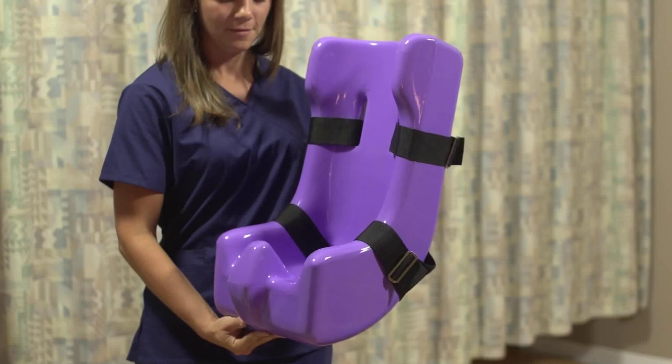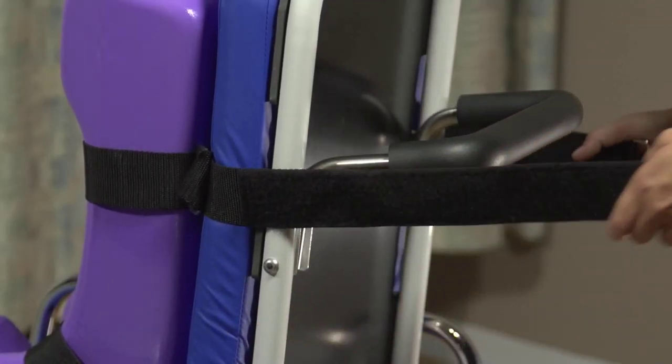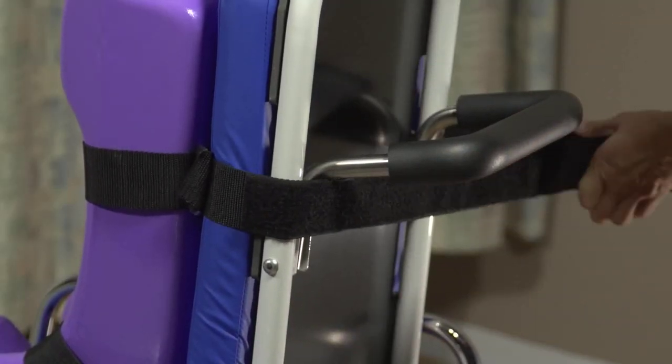Pediatric tumble forms are a popular accessory for the TMM3. Available in small, medium, and large, they allow you to safely perform swallow studies on children and infants. Just use the belts provided to attach the tumble form to the back section of the chair.